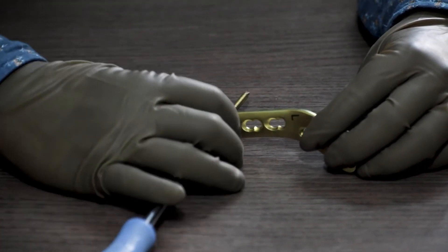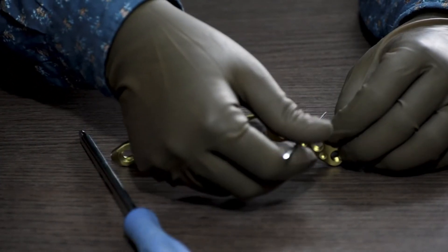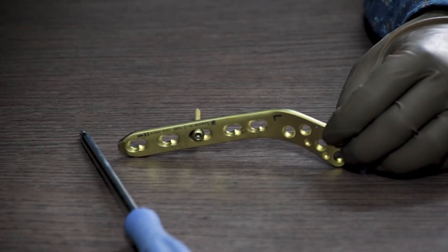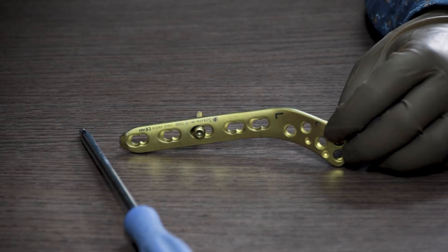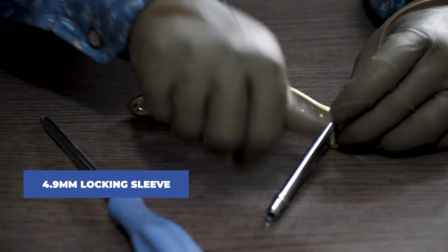After fixing the cortical screw, we remove the K-wire which is holding the plate so that it does not get bent. Next, we will fix the proximal part of the plate, for which we will fix a 4.9mm locking sleeve in the locking hole in the proximal part of the plate.